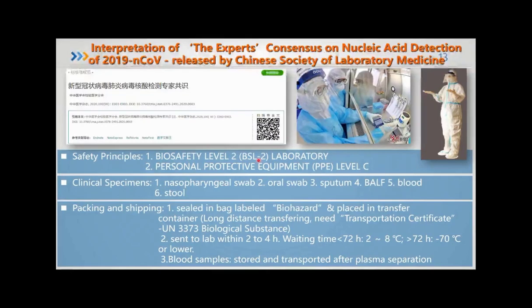The nasopharyngeal swab, oral swab, sputum, BAL, blood, and stool specimens are suitable for PCR test. So the specimens should be sent to the lab, the sooner the better.